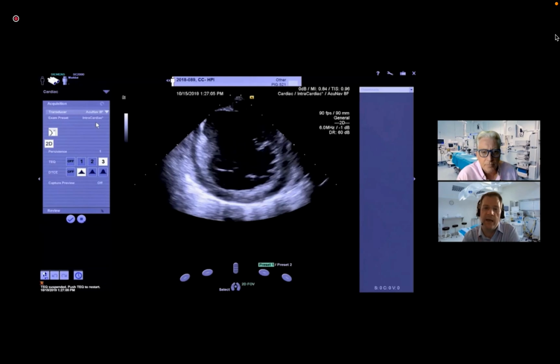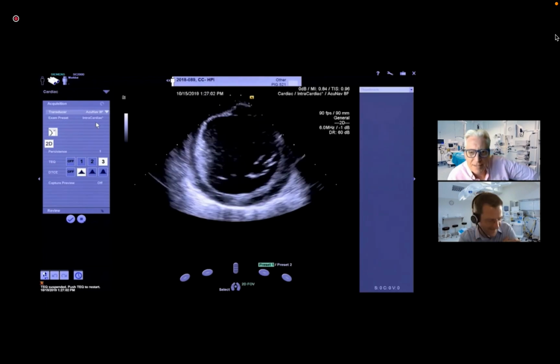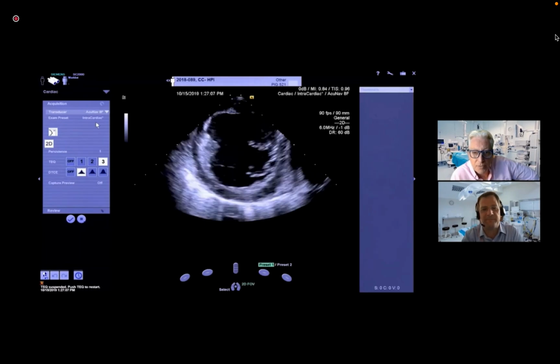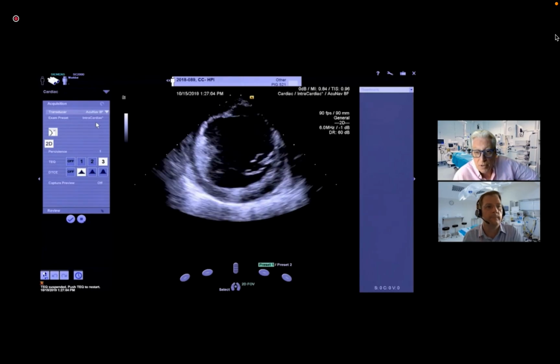Indeed. So, Monty, you're more cardiac than I, so just talk us through what this is. I'm a recovering cardiothoracic anaesthetist, but this is a short axis view. This was taken with the cardiac echo, so a very nice short axis view of the left ventricle, just around the level of the mitral chordae there. A typical so-called donut view.